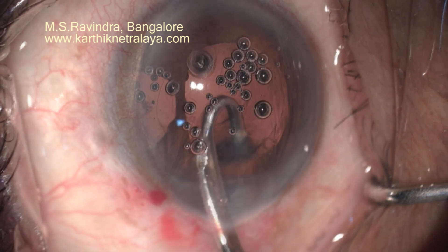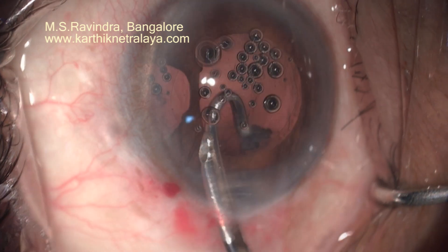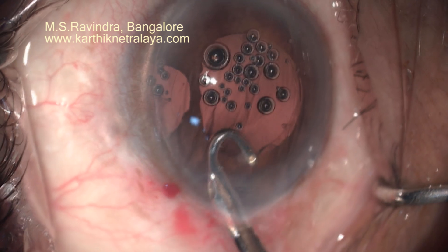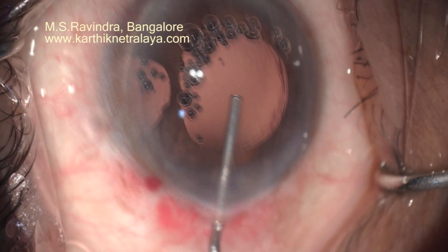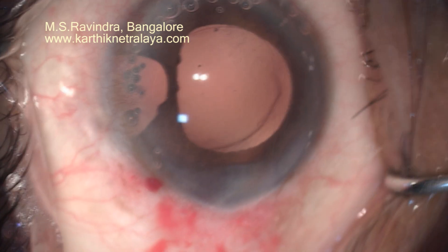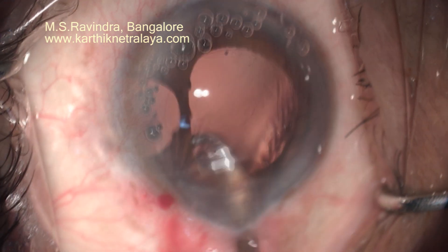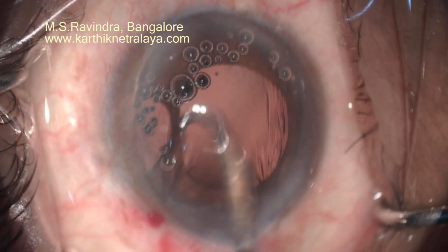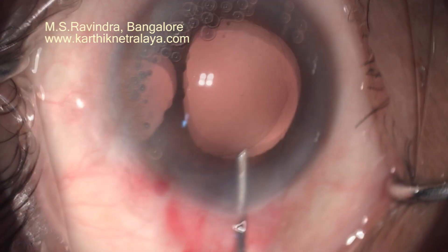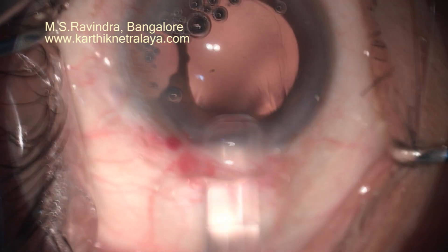The entire procedure is an open chamber technique where the connection between the anterior chamber and the outside is kept open. There is no pressurization of the chamber at any point of time. The entire surgery is a low-pressure technique, low-flow technique, low-vacuum technique, and the anterior chamber is not deepened at any point except when performing the capsular steps.